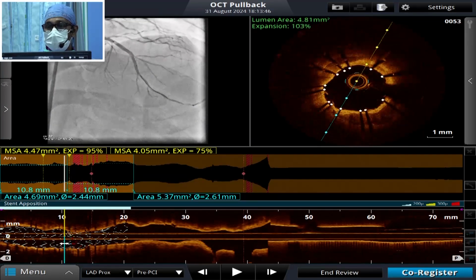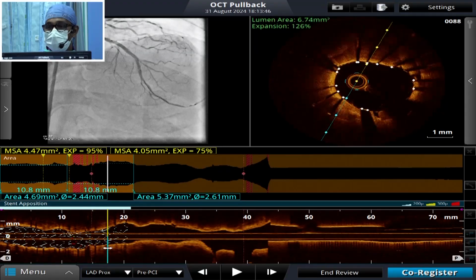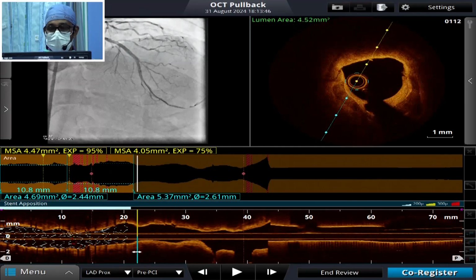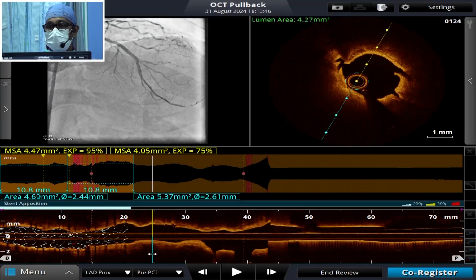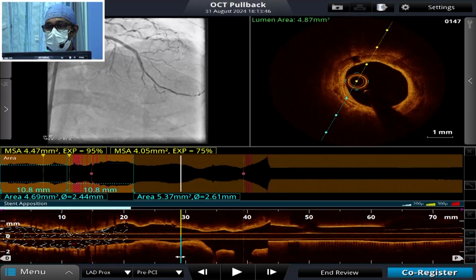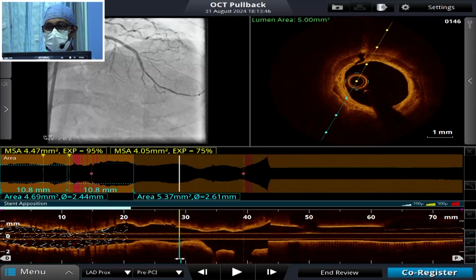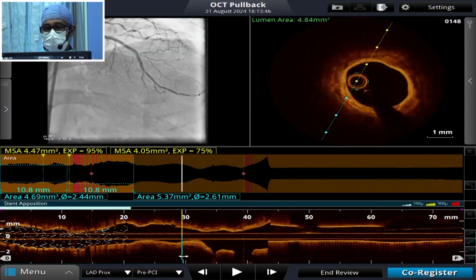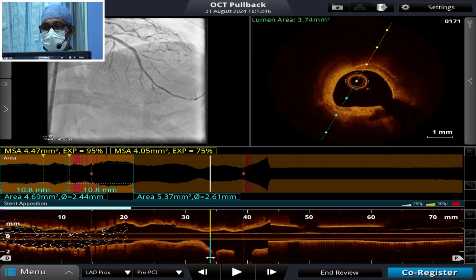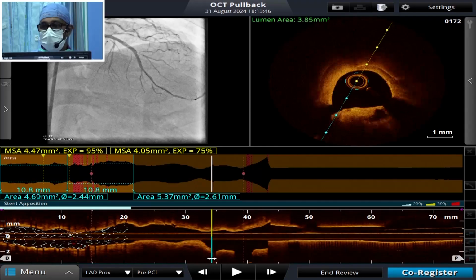Inside the stented segment, there are multiple areas of cracks. So those are the stented area, and proximally probably we would have post dilated these areas. Do we need debulking there, sir? It's all very thin calcium, no? Yeah, in fact, the balloon, when we dilated in this particular area, did not open up well. So probably we'll go with a bigger balloon, probably 3.5.